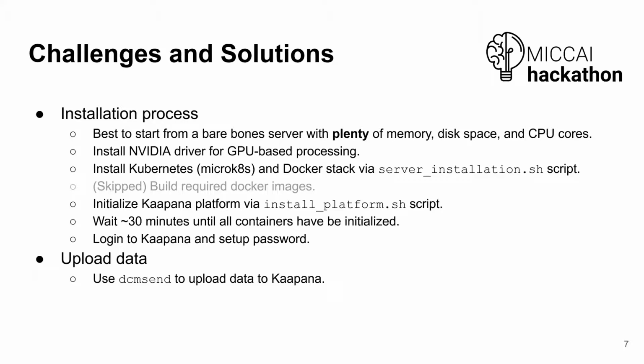And then you can finally log in, set up your initial account, and then upload the data. In our case, we did this with a DICOM send command. Since Kaapana is compatible with DICOM, this works seamlessly, and then you could access it from Kaapana. Go to the next slide, please.